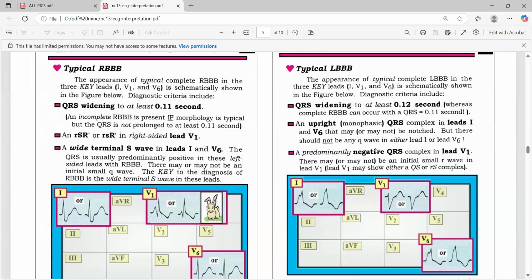I hope that makes sense to you. All you need to remember is which points you are looking for. You don't have to go into great detail, because this is how you actually work in daily life too. So if you can pick up a few things, that will be more than enough for you.